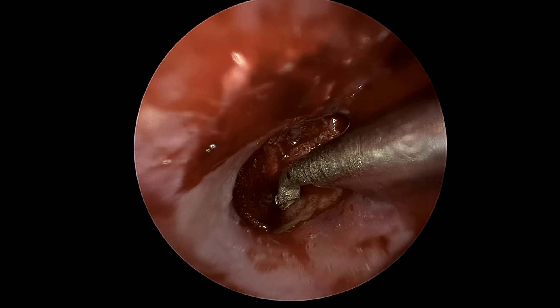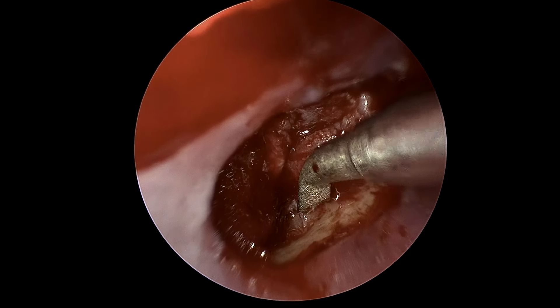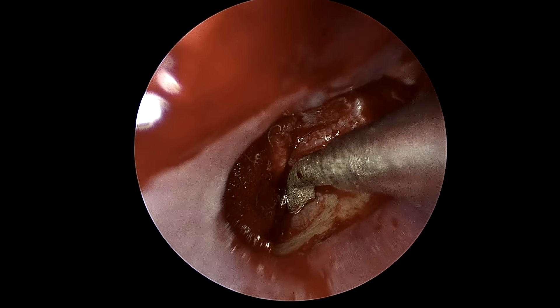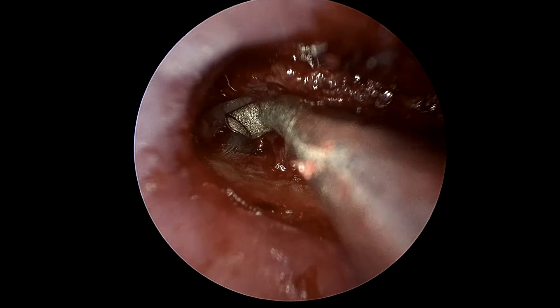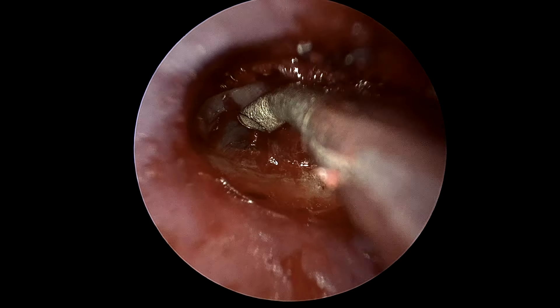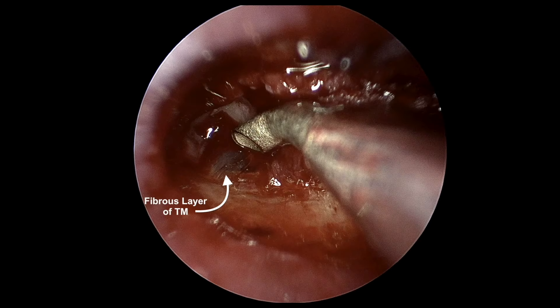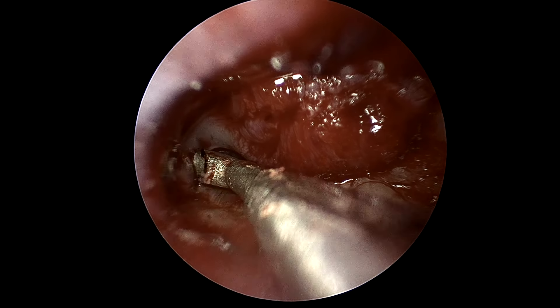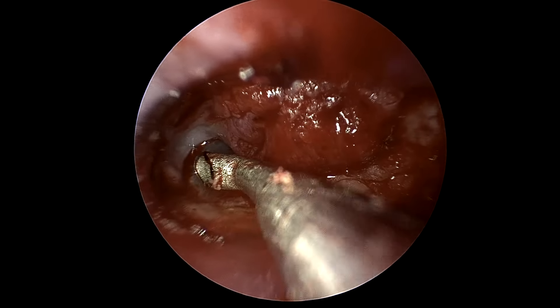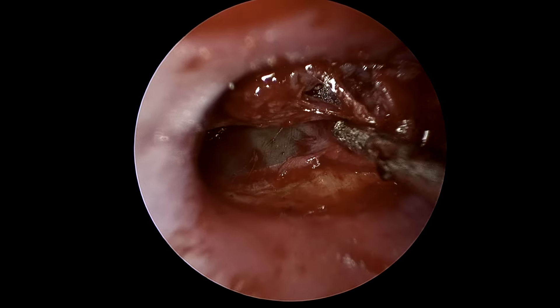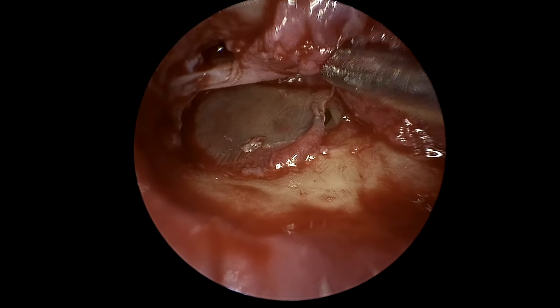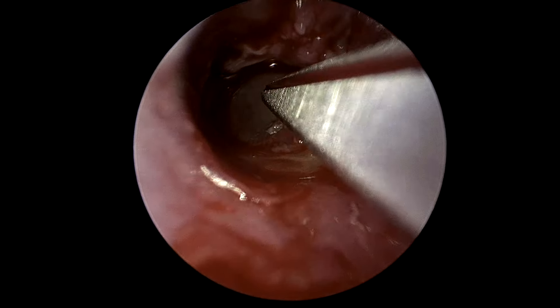As the canal skin is rather tenacious, raising the flap is rather tedious. However, after a bit, we are able to get in the right plane between the canal skin and the fibrous layer of the TM. The fibrous layer is slightly translucent. We will raise this layer off circumferentially. Tough bands are cut with a scissor, and the skin is sequentially raised off the fibrous layer with a variety of instruments.